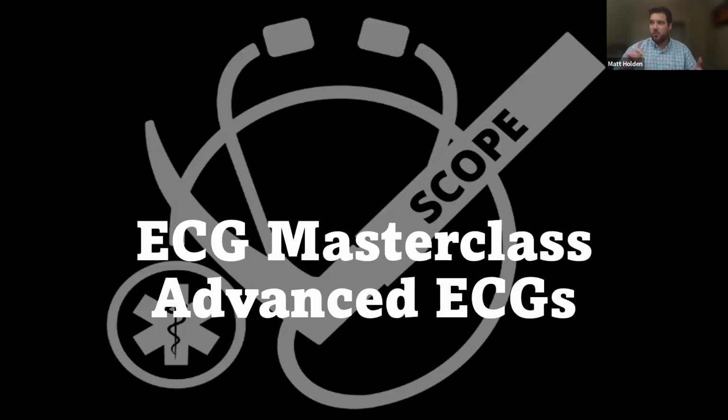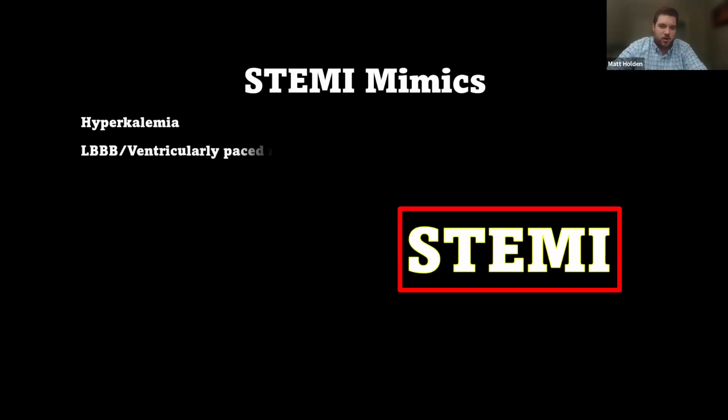Let me see if I can pull up the chat, move it over here. I have multiple monitors here, so I'm trying to watch both at the same time while doing the advanced EKG class. Jen was doing a couple giveaways with some EKG badges, and I went through all the comments and saw a couple topics I wanted to cover as they seem to be the most popular. First off, we're going to be talking about our STEMI mimics, and there's a decent amount of them.